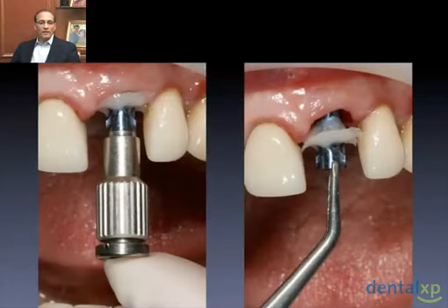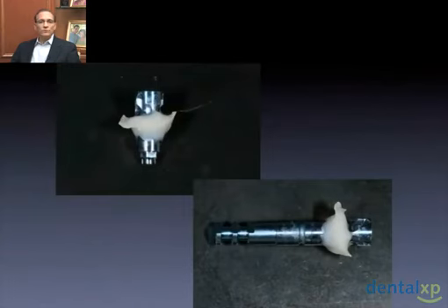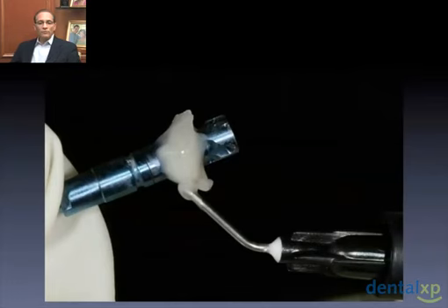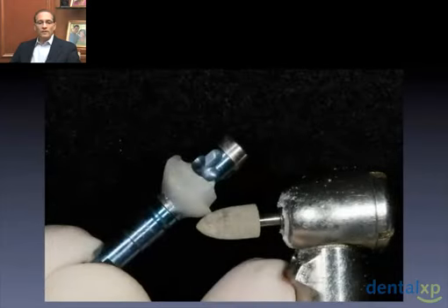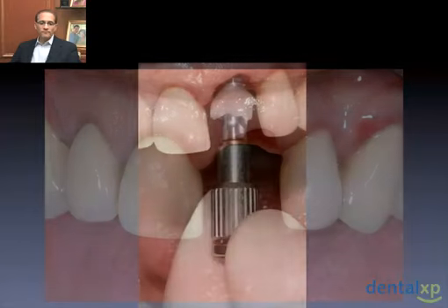We unscrew it and tease it out. And just like the original provisional abutment, it's a little amorphous. We need to spend a little time flowing composite around it and creating subgingival contours that mimic the subgingival contours of the provisional abutment that we've already created. We do the exact same thing as if it was the provisional all over again. We shape, polish, and complete the impression coping.